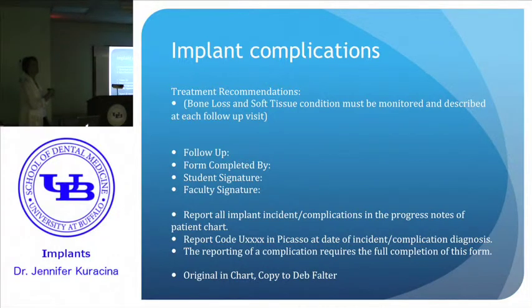No, I was just wondering in my mind about cross-referencing patients to databases, but we can do that by either the implant production stage we have, Picasso, or the surgical restorative implant production.